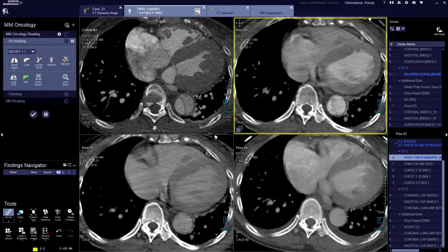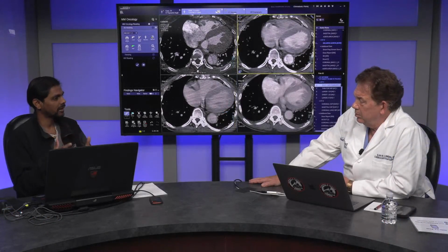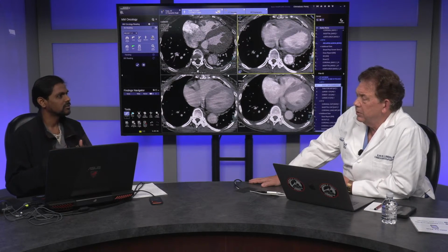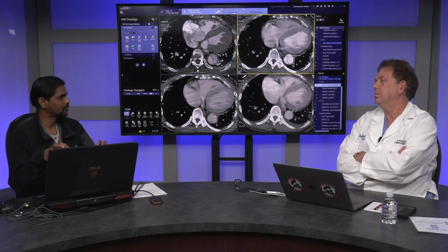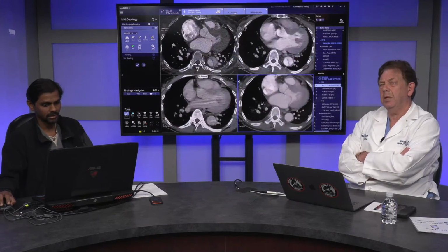So there are thousands and even more of CT data sets where the algorithm knows how to find the iliac crest, aortic arch. It's trained to identify these shapes: shoulders, scapula, ribs. Once it finds that, it estimates where things are. It identifies the kidney based on the shape, for example, and then it aligns it based on that contour.